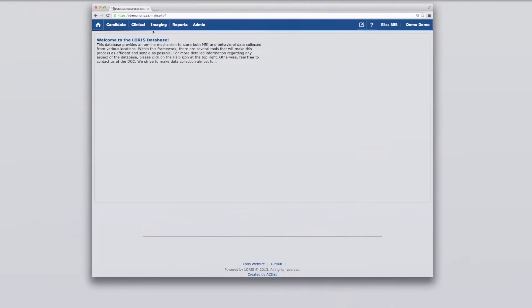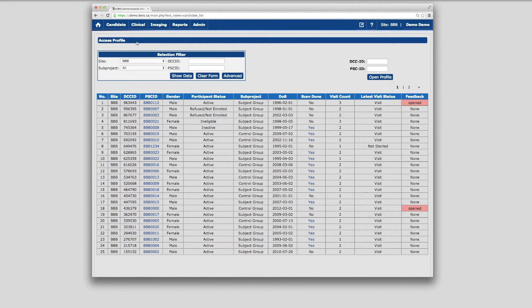From the menu bar along the top of the screen, under the Candidate menu, you can either register a new candidate profile for your study, or click on Access Profile to view the list of existing candidates and behavioral or clinical data already entered. This brings you to a screen showing all study subjects registered in LORUS to date.